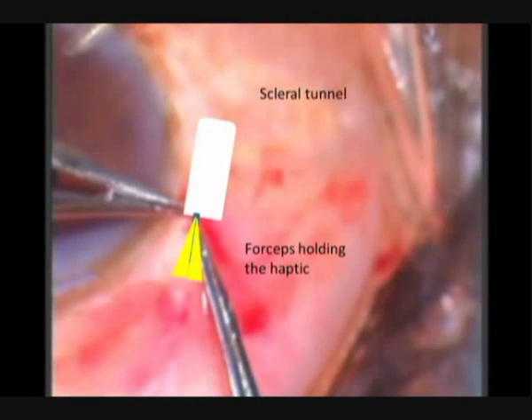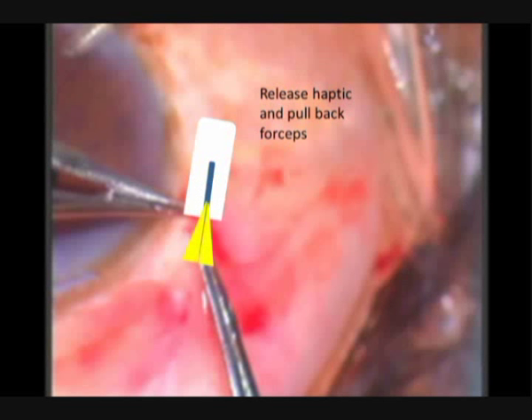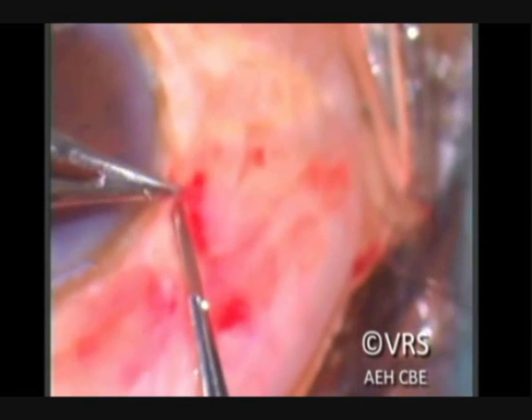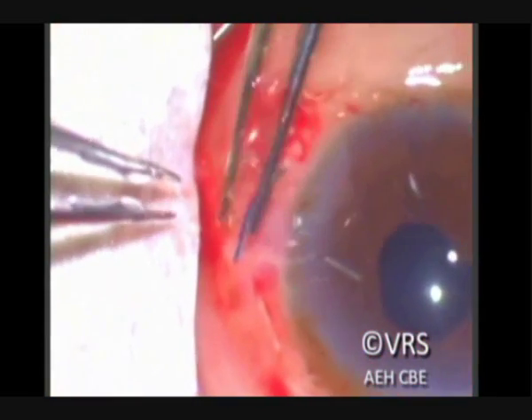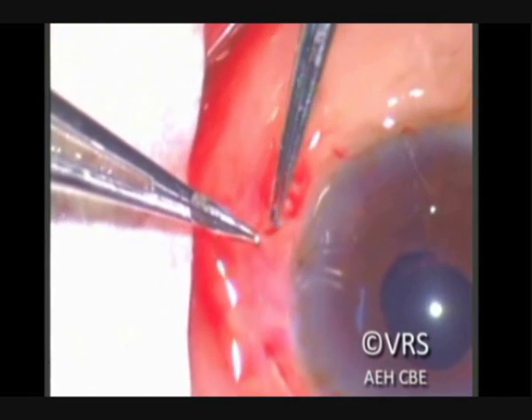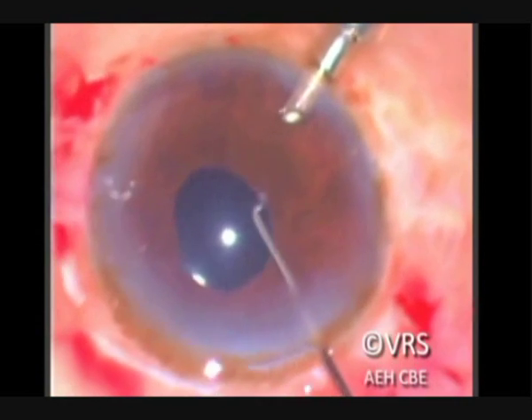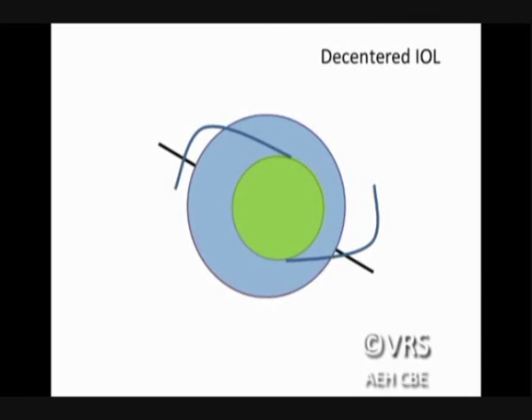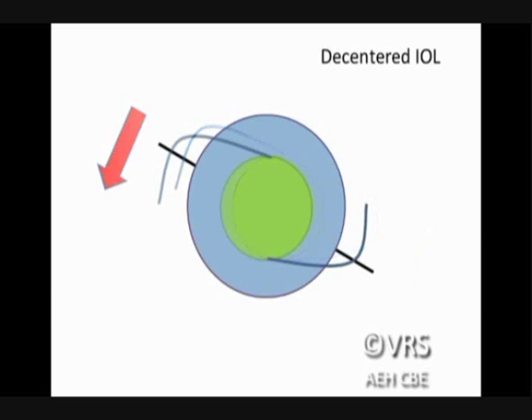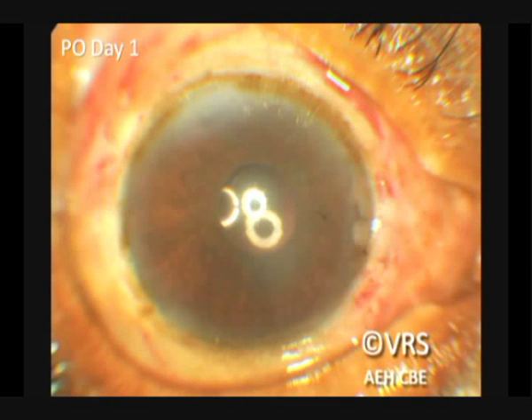Because this is a small tunnel, part of the haptic is first inserted and the forceps is released, brought back, held at the base, and then the haptic is further inserted into the scleral tunnel. The same procedure is then repeated on the other side. The position of the haptic can be checked by rubbing the sclera and identifying how far the haptic has been inserted. Centration can also be observed by noting the centration of the optic in the pupillary area. If the IOL seems decentered, the haptics can be inserted on one side and pulled out on the other to accommodate for this decentration. If there is any leakage seen at the site of haptic externalization, a suture can be used to close the groove which was first made.